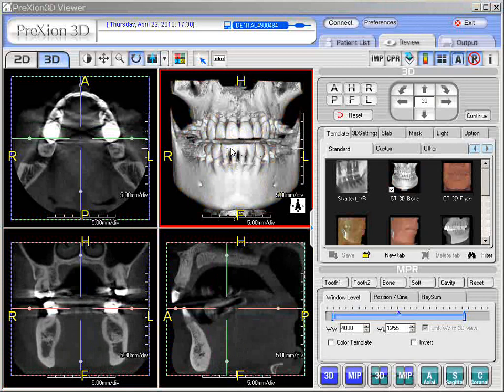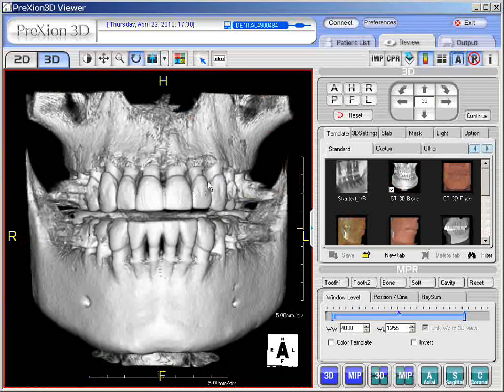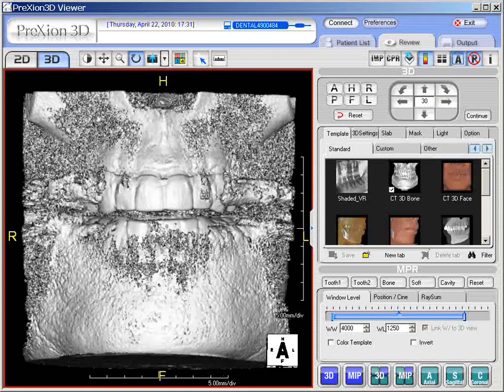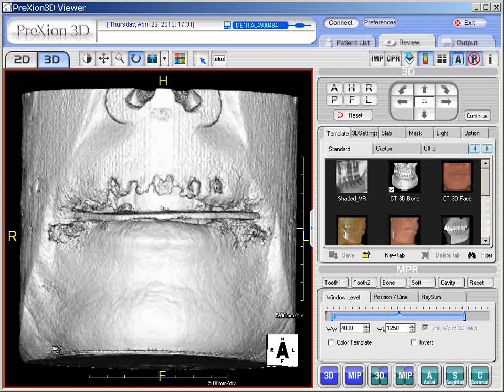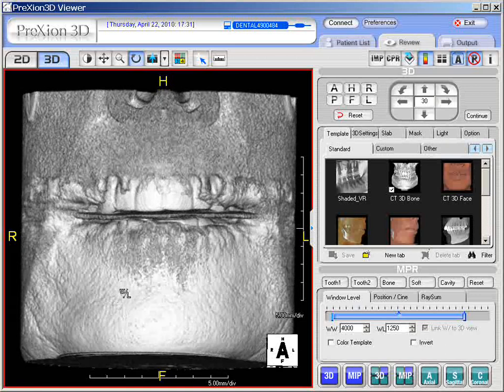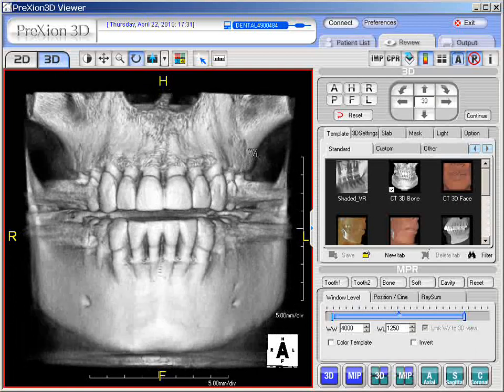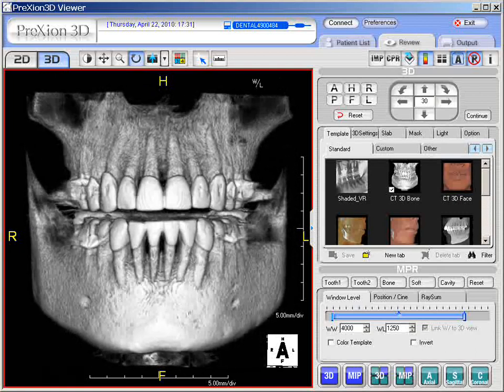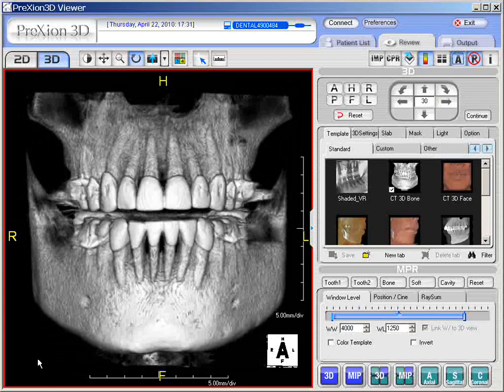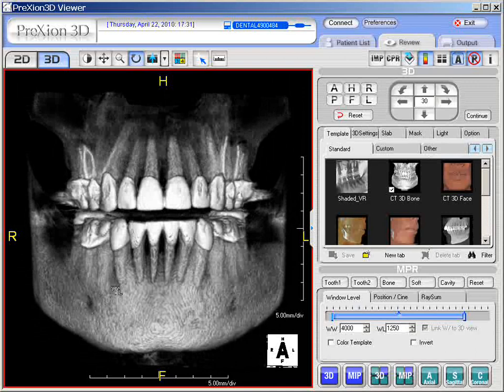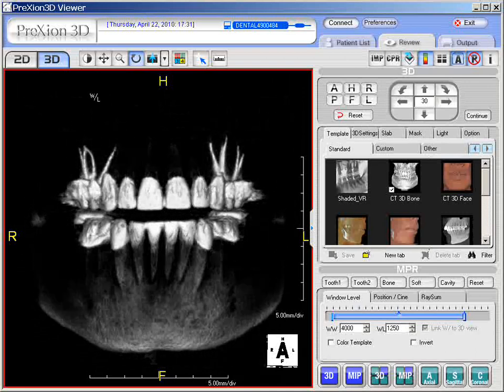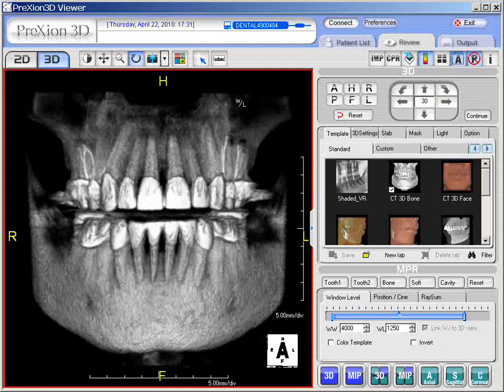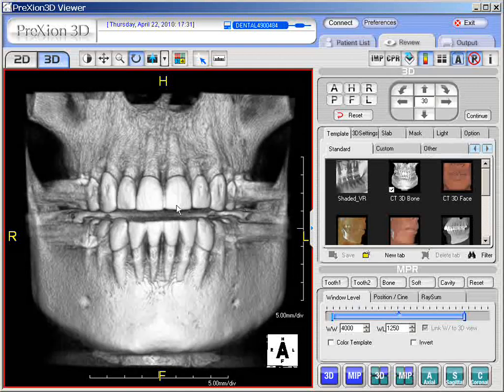Another feature of the mouse is the window level. If we launch to a single screen, by holding the right and left click of the mouse together, you can see in the corner a symbol W over L meaning window level. If you hold simultaneously and move to the lower southwest corner, you get a full tissue mode. Moving up to the upper right corner gradually removes soft tissue and leaves just the bony elements. Release and re-engage to adjust: moving from the southwest to the northeast corner removes softer tissue and leaves the harder bony elements.